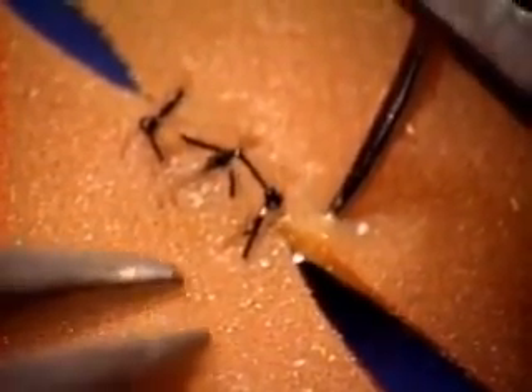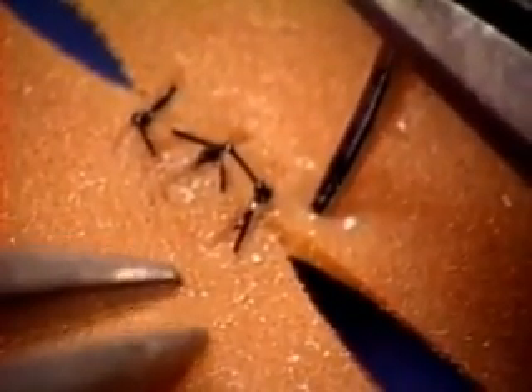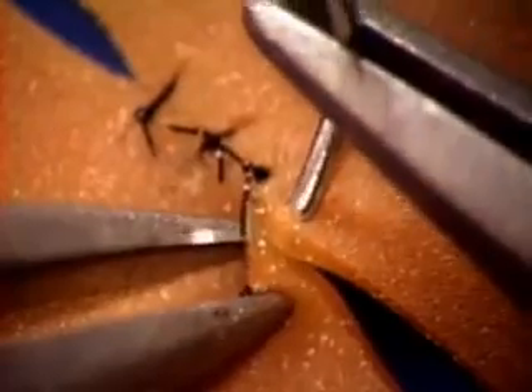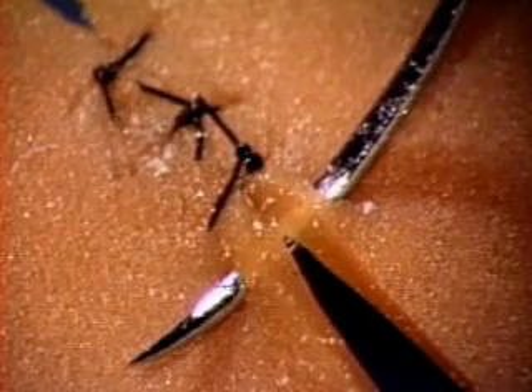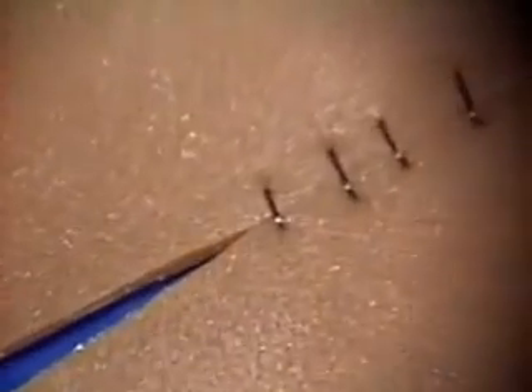At the moment when you push the needle through, do not let go of the needle. Move the needle tip to an exactly matching exit point on the other side, bring the left hand forceps in from above, and press down toward the needle again, everting the tissue as the needle goes through. You're aiming to produce two equal-sized bites with the needle crossing the wound at 90 degrees. When tied, the underside will look nice and flat.